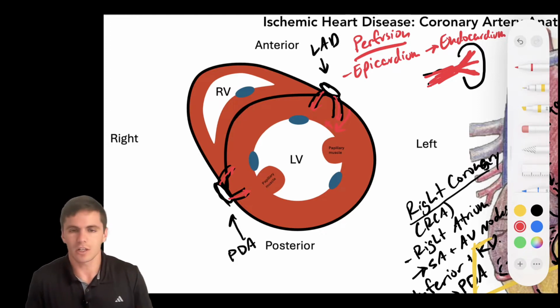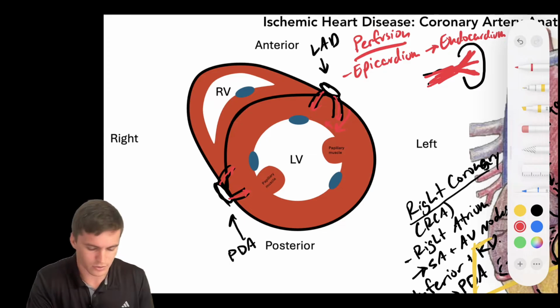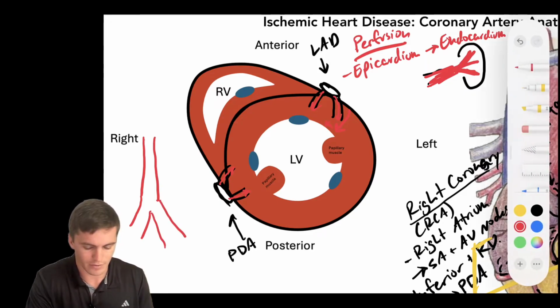And so let's talk a little bit about a vascular event. We'll start to draw and understand this idea. Say I've got this vessel, right? If I just take a vessel out of the heart, and it's branching off as it's traveling into that myocardium, right?